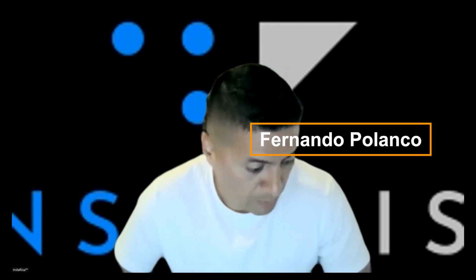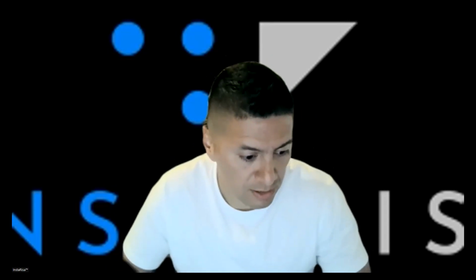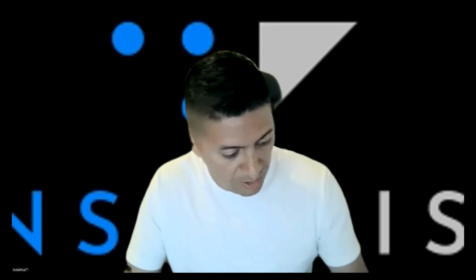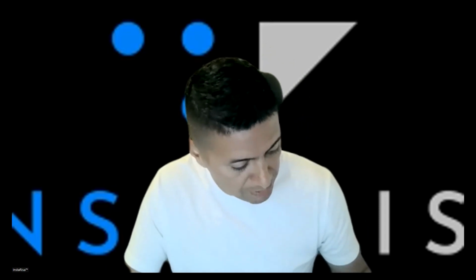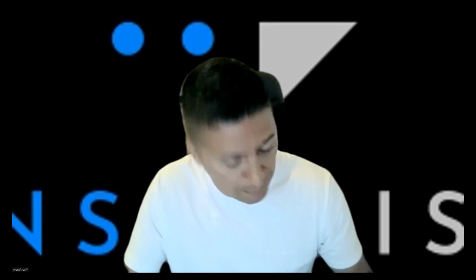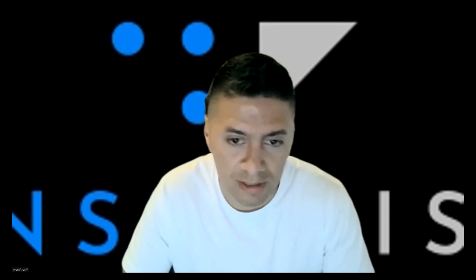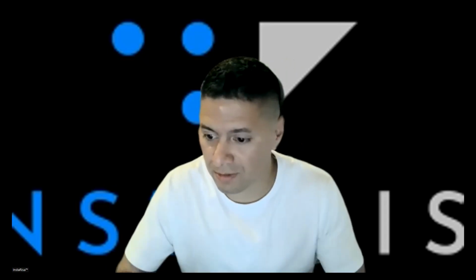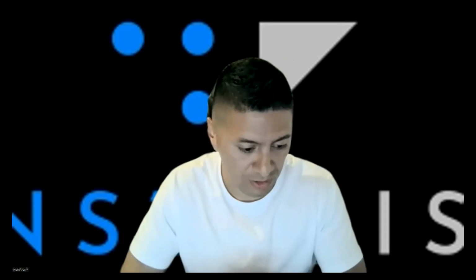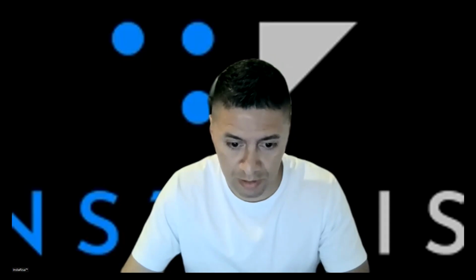Yes, my name is Fernando Polanco, and I started my journey as a dental assistant. I got introduced to Exocad in 2015. My previous doctor came and told me, "Hey, Fernando, I'm gonna start going into the All-on-X, All-on-4 business," and here we are. I'm glad Hassan invited me to do this webinar and show what's possible with Exocad. So let me share screen.